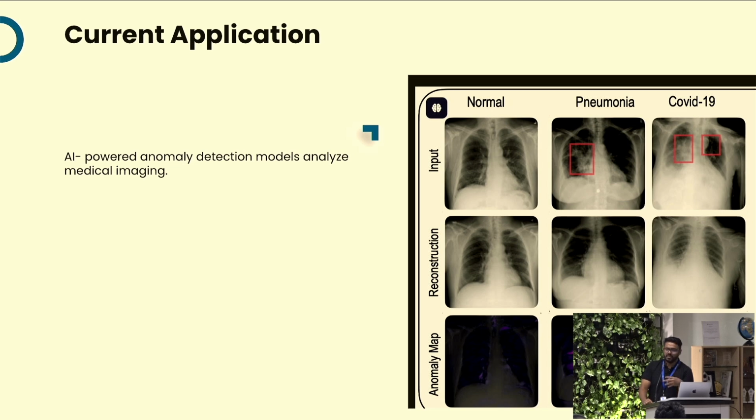And most of these conditions, where detection is happening through imaging, can be done this way. But again, the asterisk here, the point to be noted, is that all of this has to be confirmed by a medical professional through a confirmatory test. Because detecting through an AI by looking at the image is still not regulated as the final call.